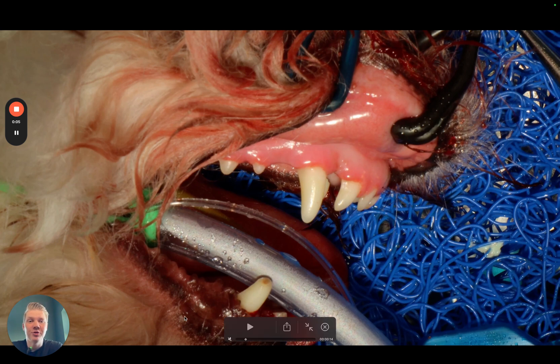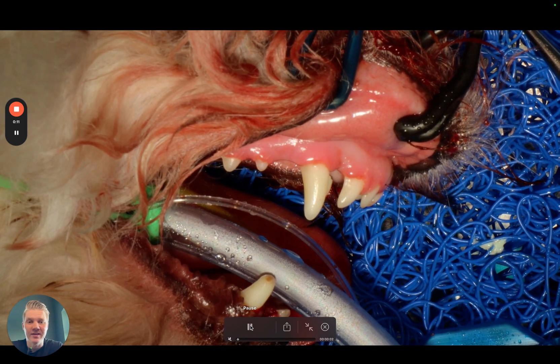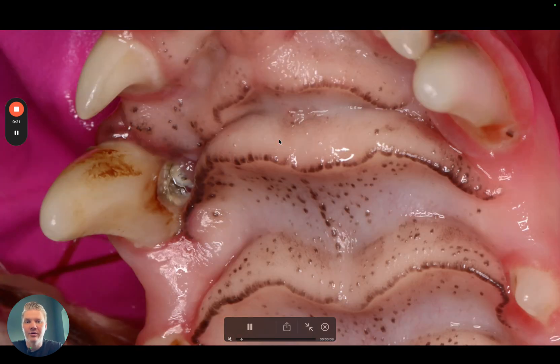Hey! In this video I want to show you how you can extract an upper canine tooth without making a flap. This was a medium sized dog brought to my clinic and he had a pretty severe problem and malocclusion, overbite, and the lower canine was hitting into the palate and on the palatal side of this 104.